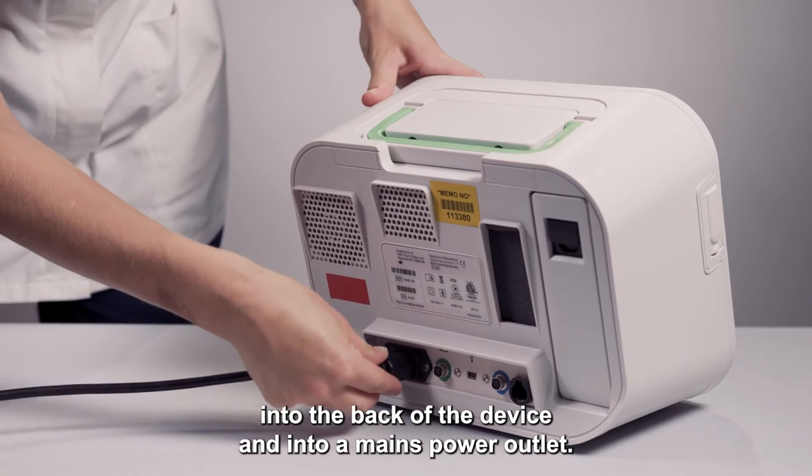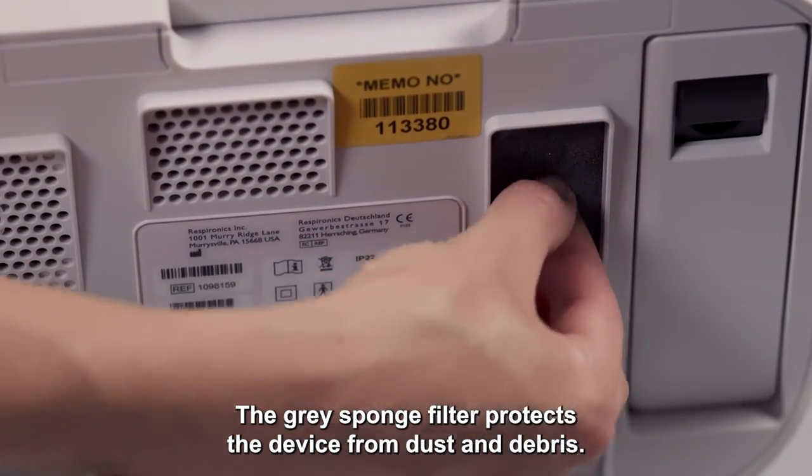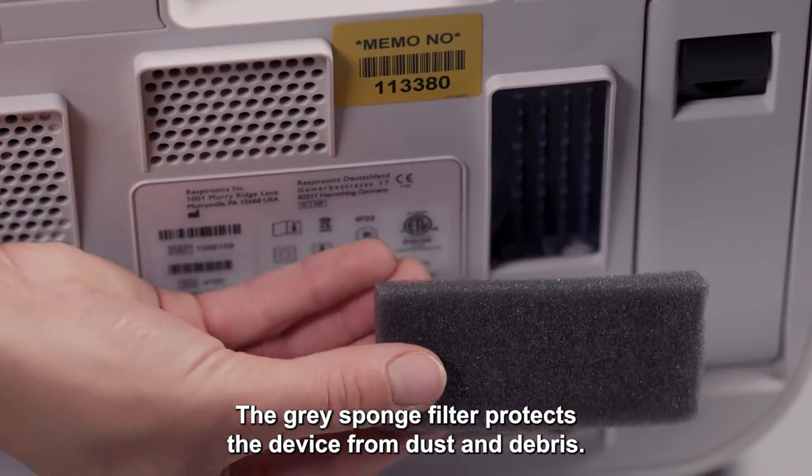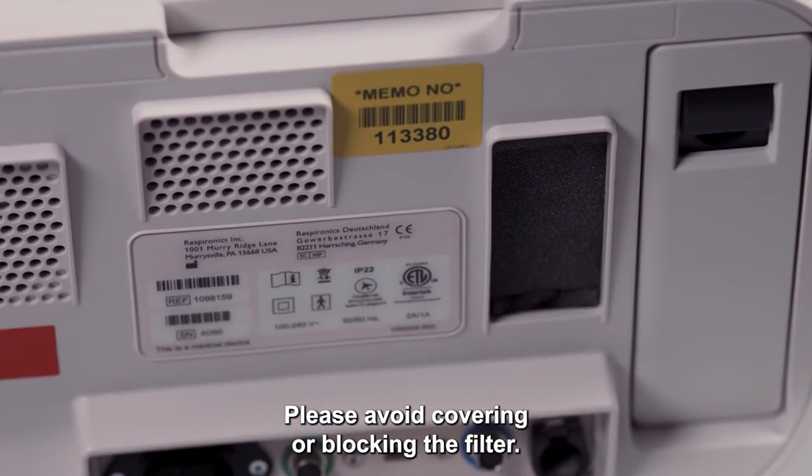Plug the power cord into the back of the device and into a mains power outlet. The grey sponge filter protects the device from dust and debris. Please avoid covering or blocking the filter.